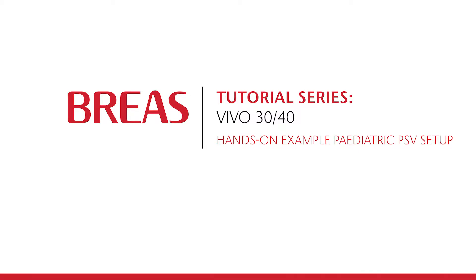Hello and welcome to the Bria's tutorial series. In this video, we will show you how easy it is to do the setup of the Vivo40 ventilator so that it can be used to supply pressure support ventilation for a pediatric patient from 10 kilos.